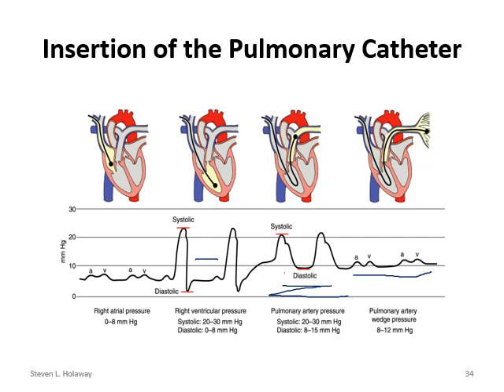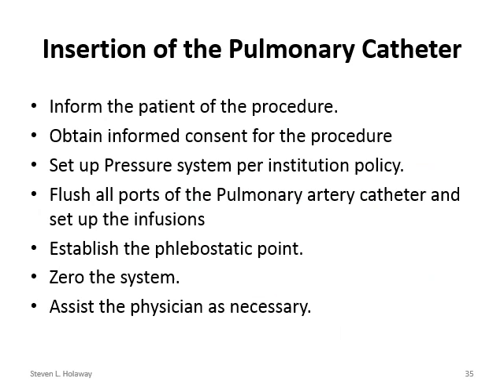Now these readings listed on the bottom are not the ones that are consistent with your book. Again, that's what I'm telling you when you look at what readings. When you get into your facility, they will have a listing of what they want you to monitor by and where you treat by. So I want you to understand what you're going to do if it's high, what you're going to do if it's low.